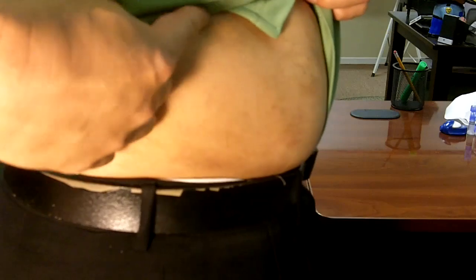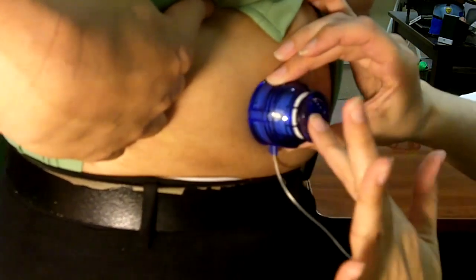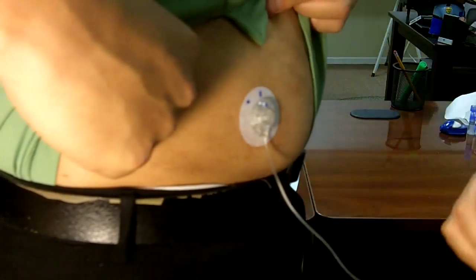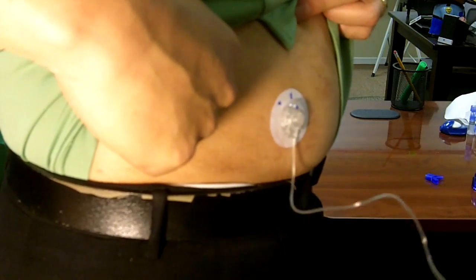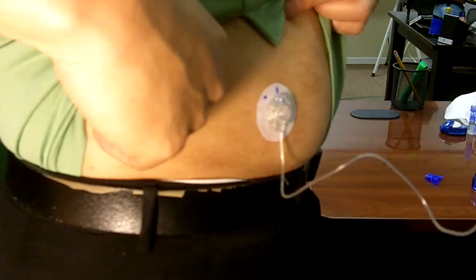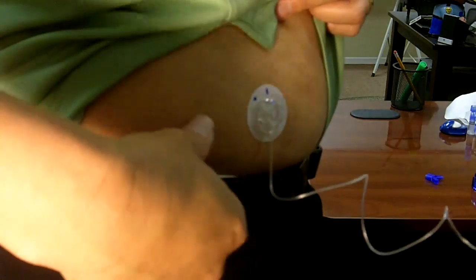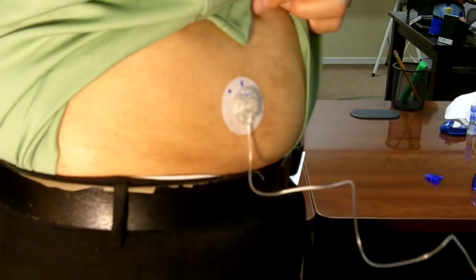You always want to give the patient that option. So, I'm going to squeeze the two buttons on the side — one, two, three — and push the button in the middle. The needle comes out, needle guard folds up. Then the last step on the pump says fixed prime, which is going to fill the little cannula that's now placed under the skin. We're going to do a little fixed prime. And now you're connected — you've got to know how to disconnect too. You can stick the pump in your pocket now.